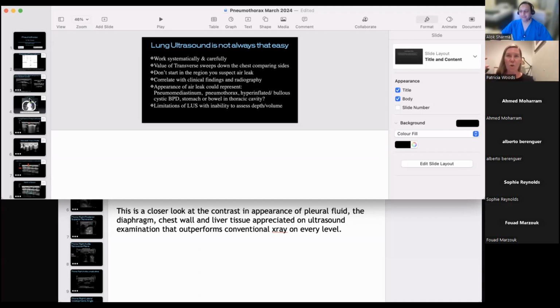But then, yeah, sure, zooming in on that really first 1.5 centimeters, fine. And I guess it depends on your question. If it's effusions, obviously, you go for your life. If it's things lower down. But for teaching, I try and keep it in a zone so that people can get a bit of reference and context. And I don't know if you found, Sophie, when you suddenly flick to M mode, it can look a little bit clearer whether the contrast is moving or not. How do you feel?